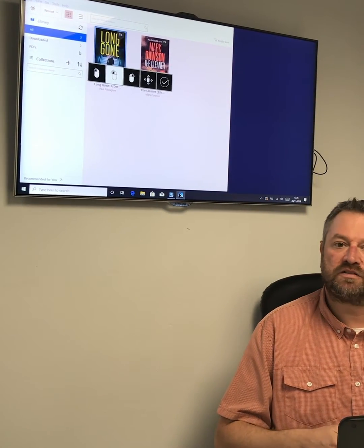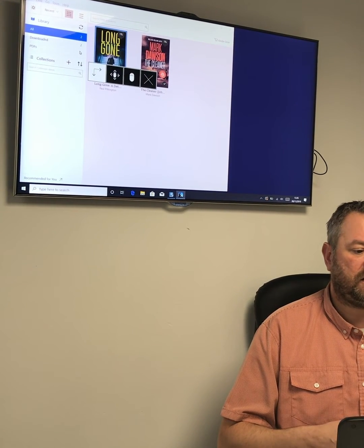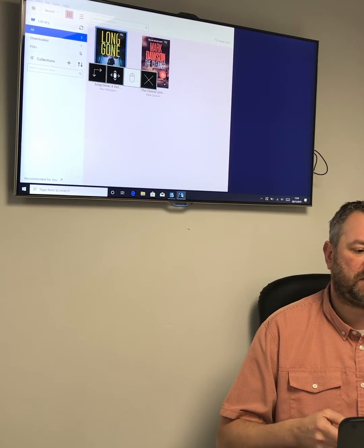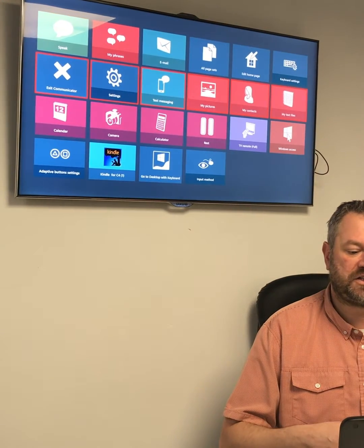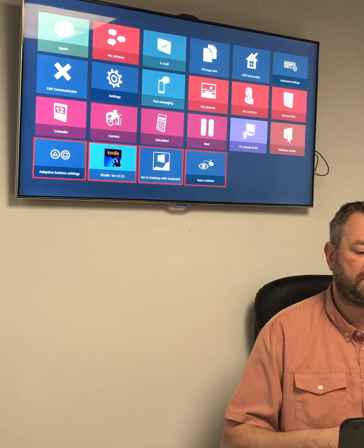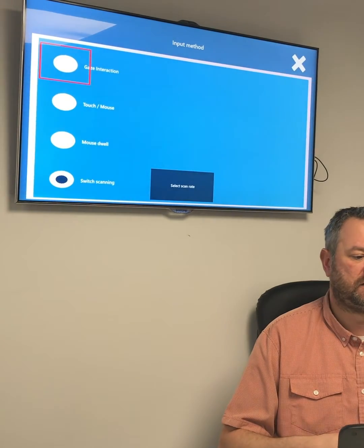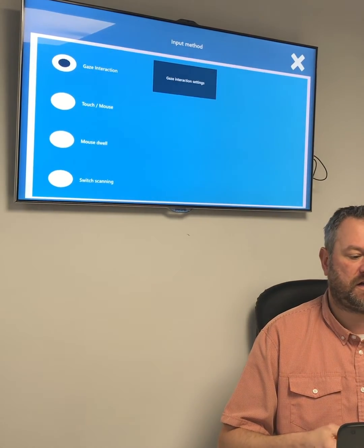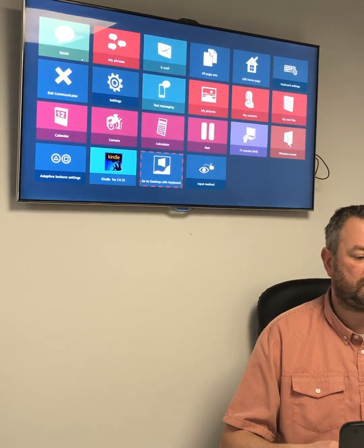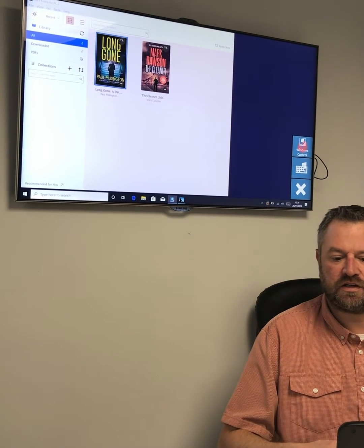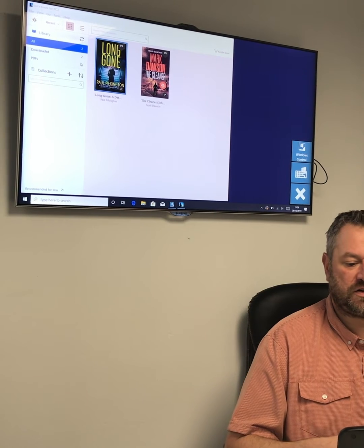I've got full Windows access with that. When I come out and go back to my homepage using my switch, I'll then change the input method back to eye tracking. We come back into the input method settings, I choose eye tracking, and I'm now back on eye tracking. When I come back to the desktop and choose Windows control, Communicator has automatically recognised that I'm no longer using a switch.